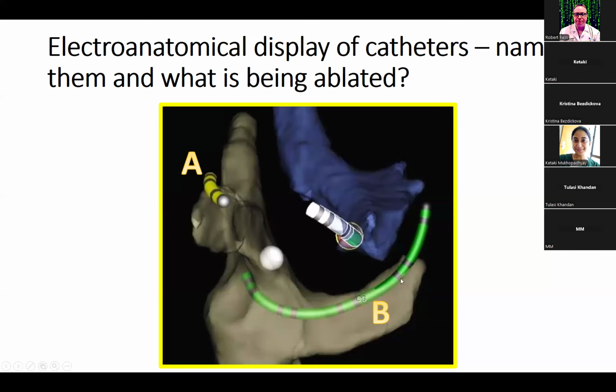Now, it might be that this pair is earlier than this pair and is later than this pair, but all it tells us is that it's somewhere from about here to here. But at least it gives us an area in which we know this is the general vicinity of the pathway because we have a coronary sinus catheter here to help guide us. There's at least one electrically stable position that allows us to know where the earliest timing is.